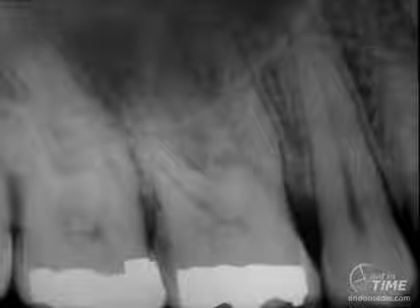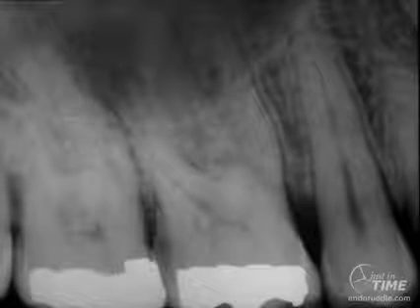If we look at our first movie today, we'll look at this maxillary first molar on the radiograph, and you can see that there's a restoration in the occlusal table. You can see the pulp chamber is quite narrow in its occlusal gingival height. And again, you can begin to interpret how those canals bend about mid-root and start to angle in abruptly into the pulp chamber. These are the triangles of Dentin that we've been talking about.